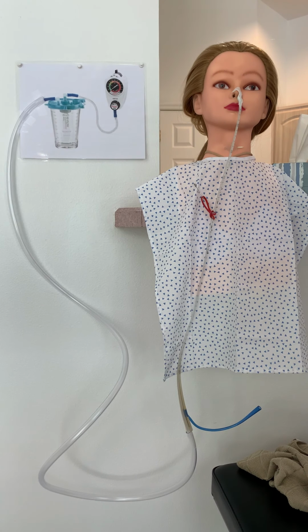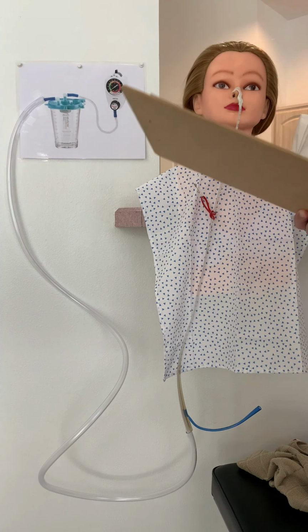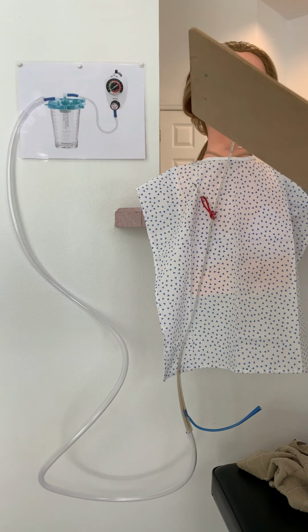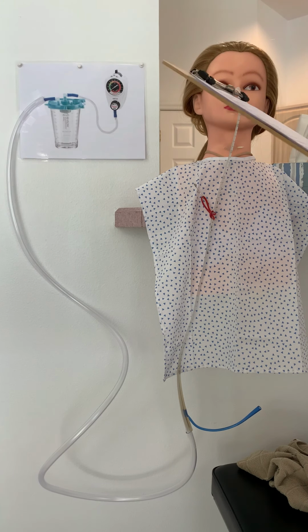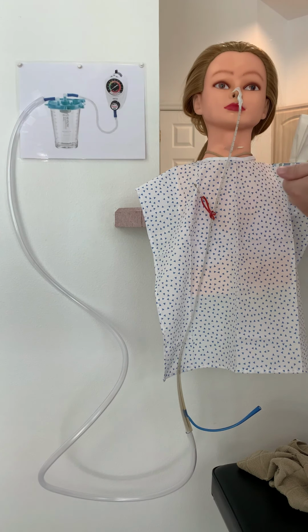It's 2 days later, and I see there is an order to remove the NG tube. So I'm going to gather my equipment. So that will be my waterproof pad or a towel, clean gloves, toothpaste, toothbrush, a washcloth, and I'll make sure I have a trash bag nearby. I'm going to get ready to go into the patient's room, so I'm going to wash my hands.